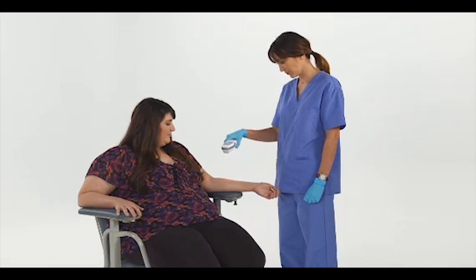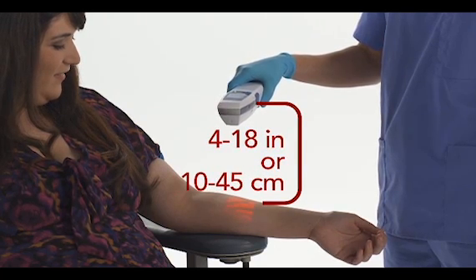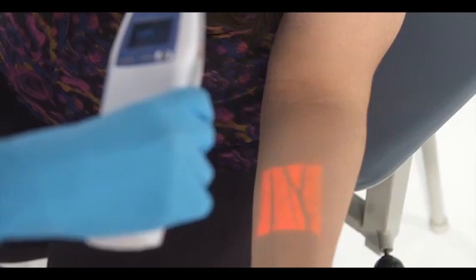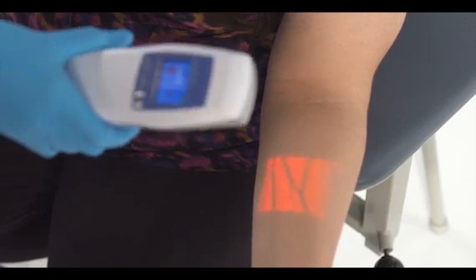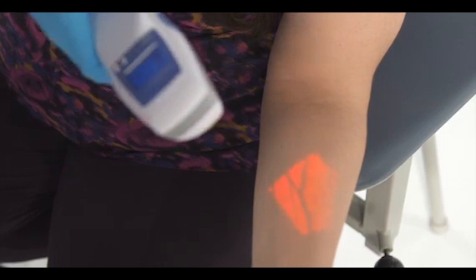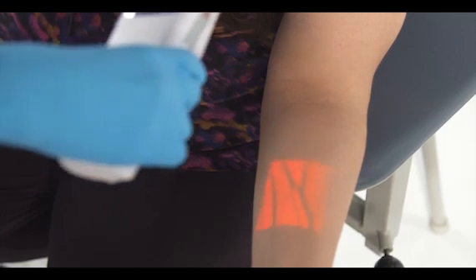Hold the device 4 to 18 inches or 10 to 45 centimeters from the skin. The device can be held in any direction. Once a vein is selected, make sure the vein display light is directly above the vein center line.